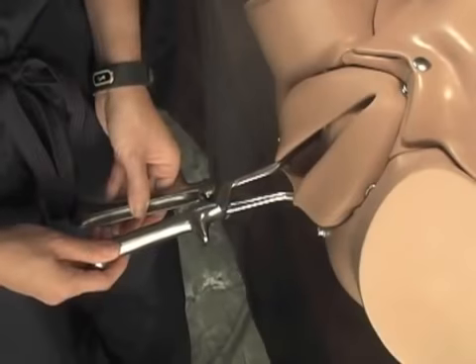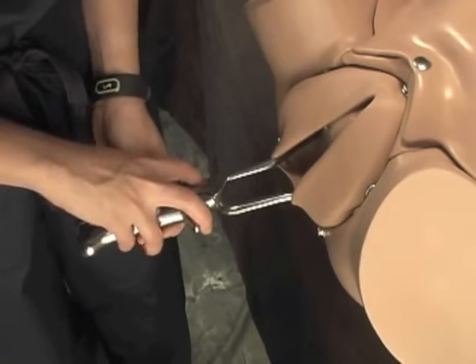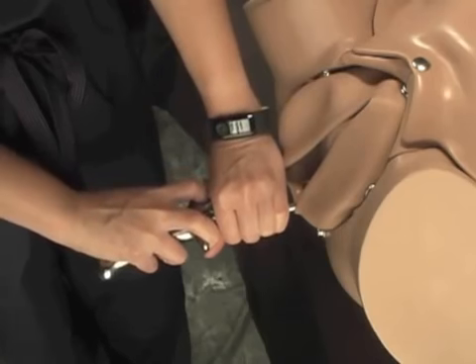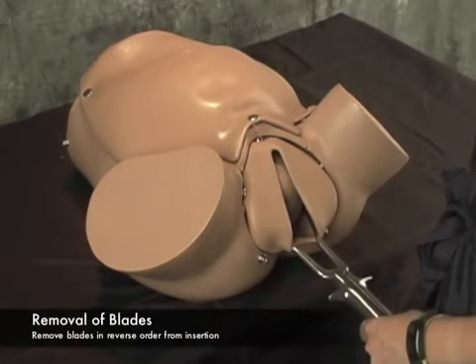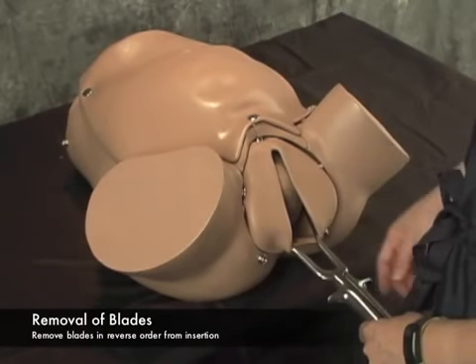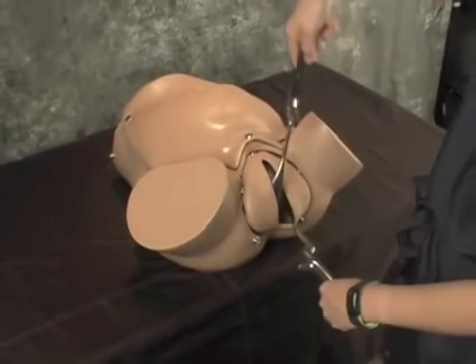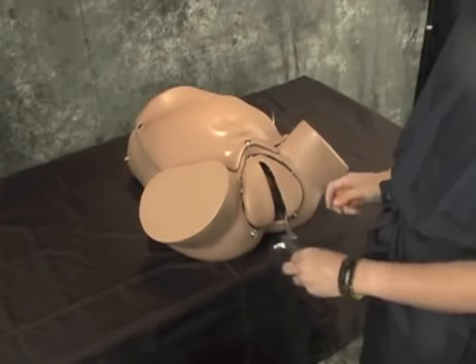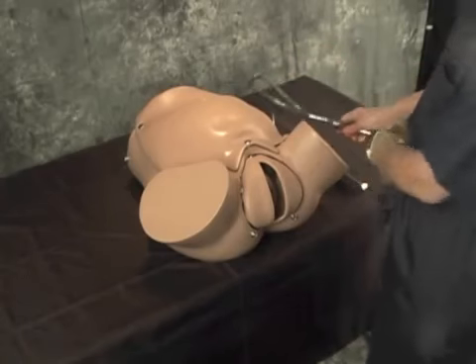Then lock the handles. Grasp the handles at the finger guards with your dominant hand while the non-dominant hand grasps the shanks. Apply downward traction using the axis traction principle. Remove the blades, reversing the order used during application. Remove the right blade first if the fetal head was in the left occiput anterior position, then remove the left blade next.